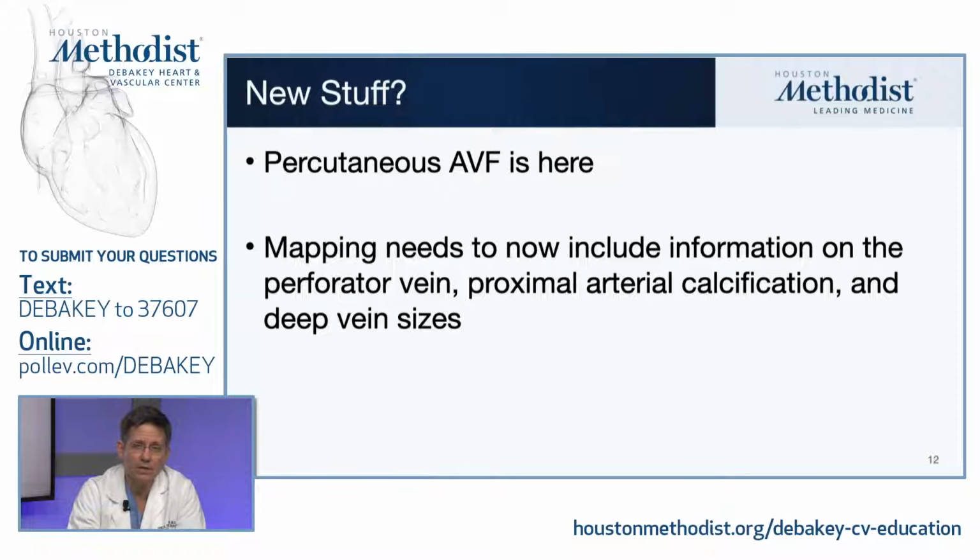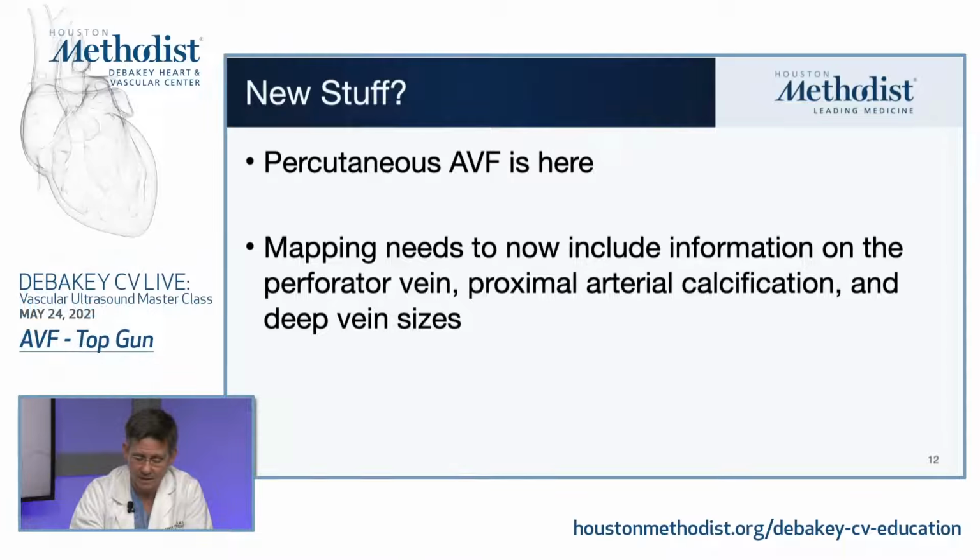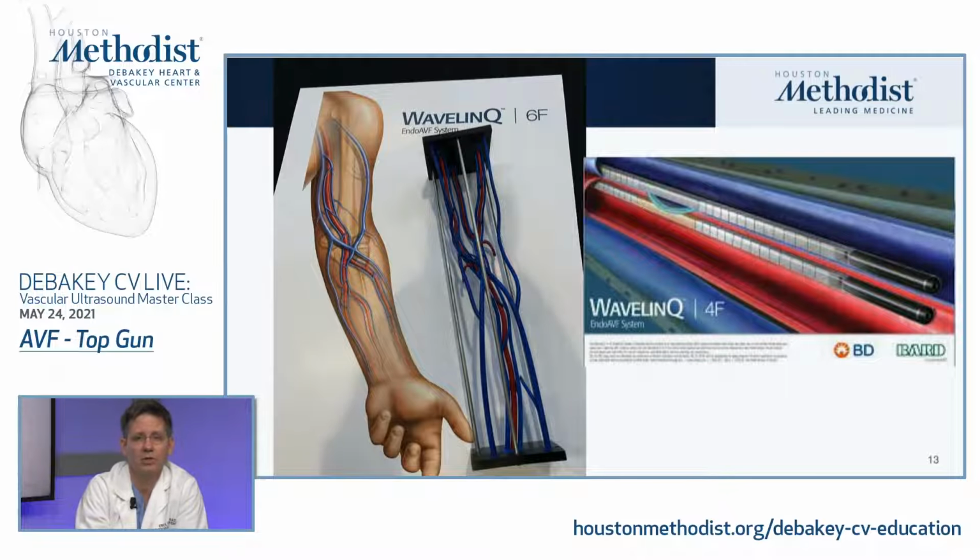In terms of vessel mapping, percutaneous fistula is now firmly here. Those have been approved in the U.S. now for nearly 2 years and have really changed the needs of the preoperative mapping status, because now we need to know about the perforator vein, which previously was completely ignored because it played essentially no role in the preoperative planning by the vascular lab. We need to know about proximal arterial calcification and actually deep vein sizes for the radial veins, ulnar veins, and brachial veins, depending on which system you're using.